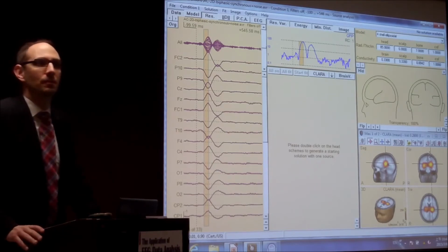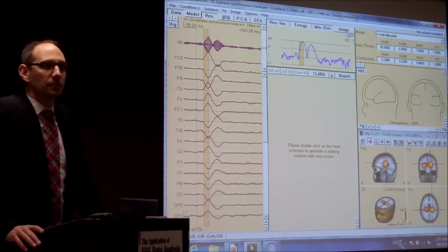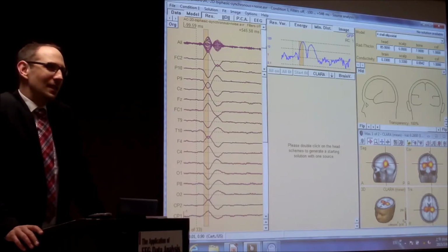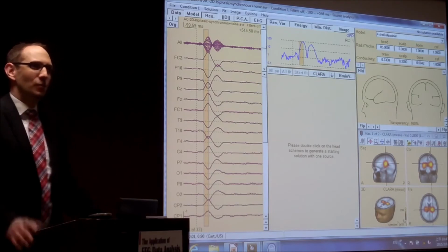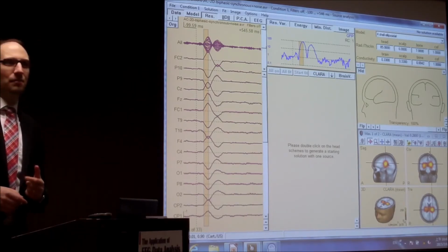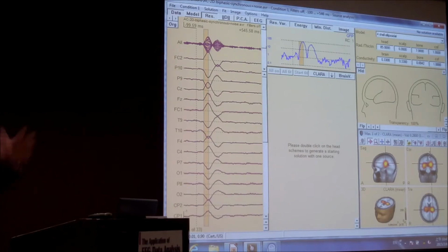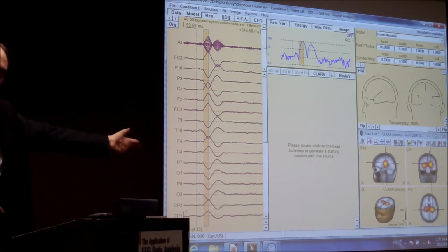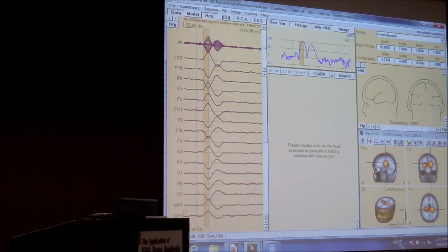Yes, can you explain different methods, the strengths and the weaknesses? That's difficult. You cannot say exactly. In fact, that really depends on your experiment. Is it strong or not? So look at the auditory experiment. You need a separation of the two sides. It's a bilateral activity. Here we can do that. That's a strength of that method. It's a weakness of the Loretta method.